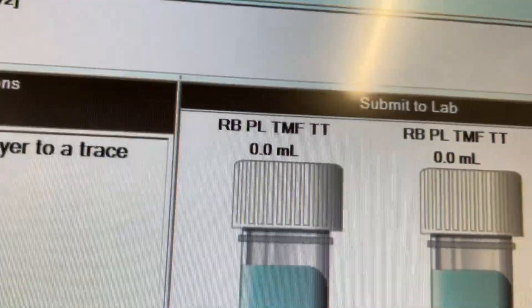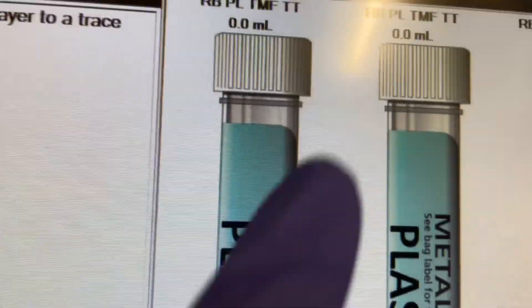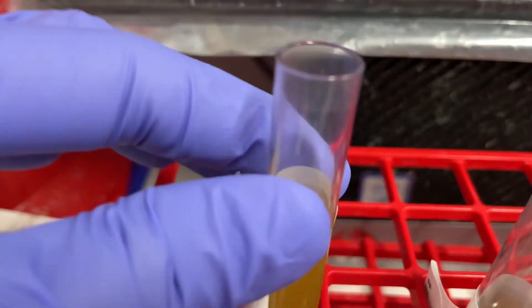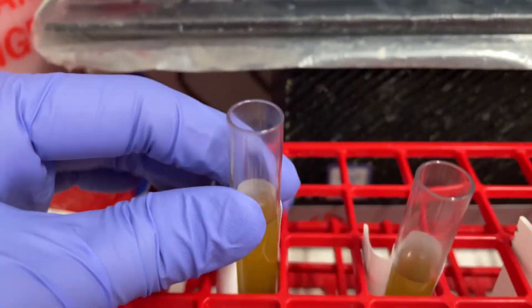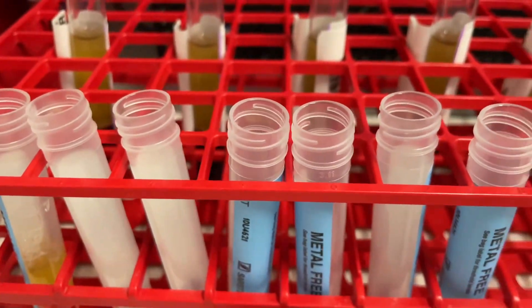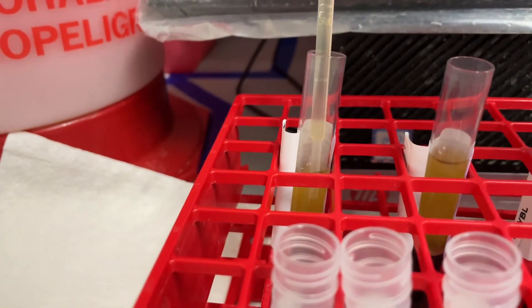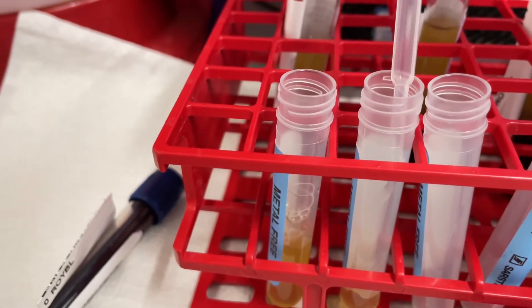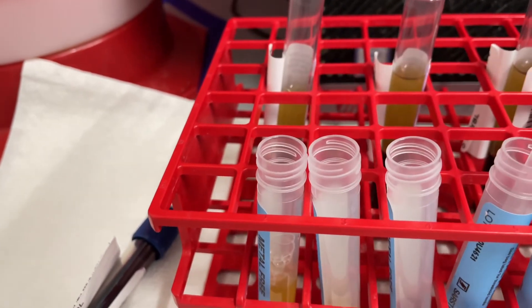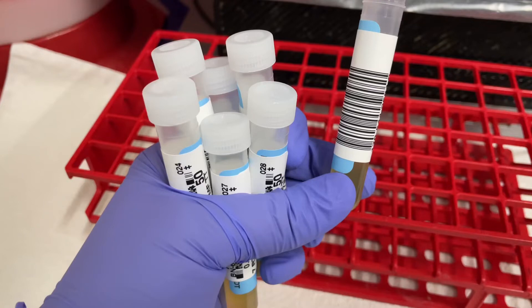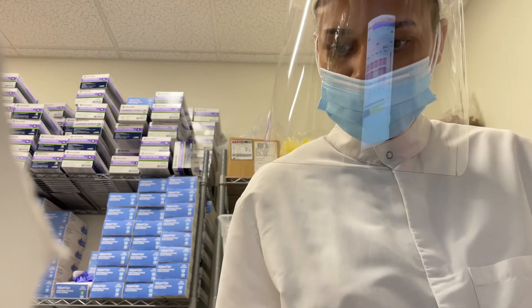I come up to my computer screen and it gives me the amount I need to put in these tubes. We've got to take this plasma and put it in these tubes. The instructions said to get the specific tubes and put the plasma in — the measurement for that tube was 0.0, which means all of the plasma and no red blood cells.